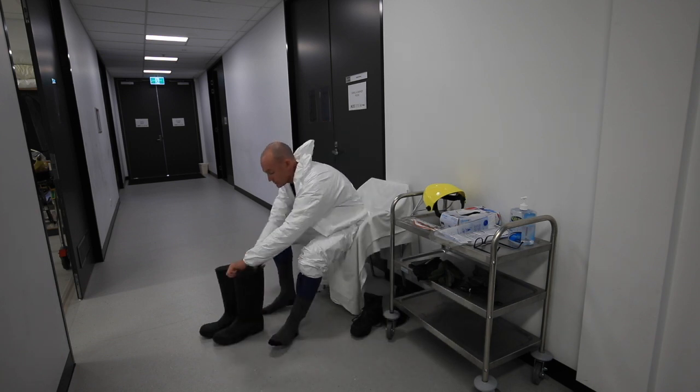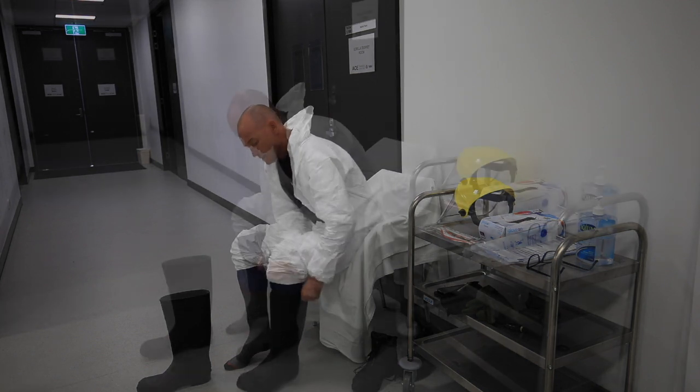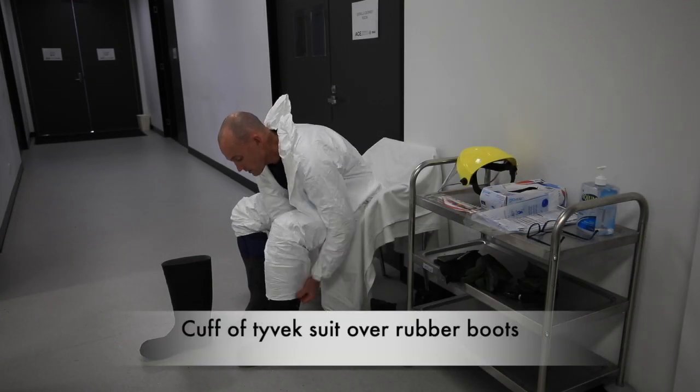Then we're going to put our rubber boots on. Just put the Tyvek suit down.